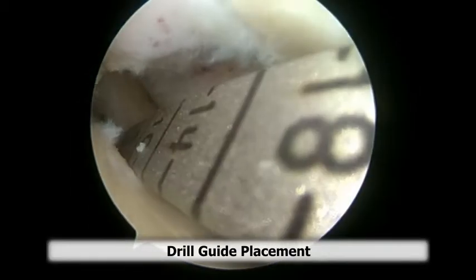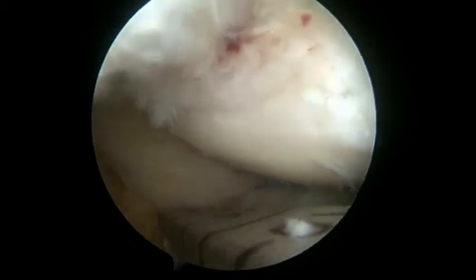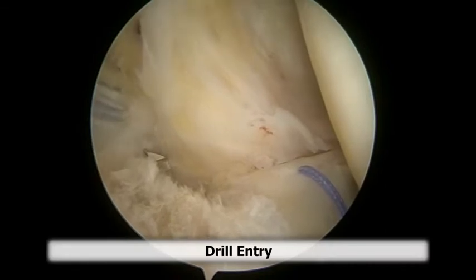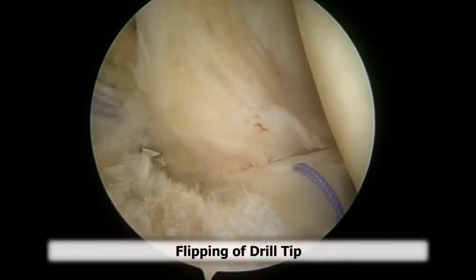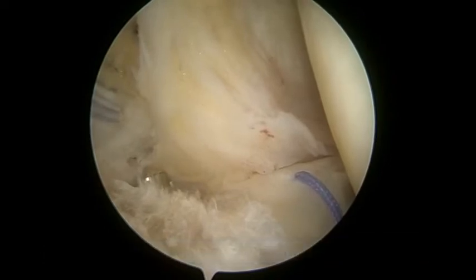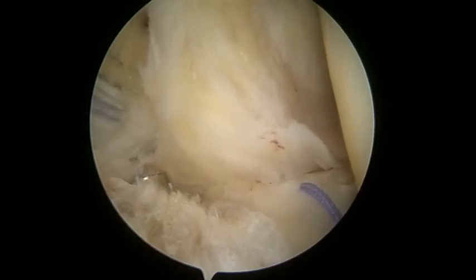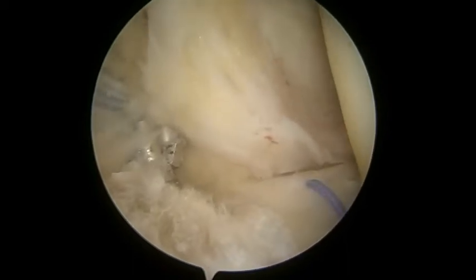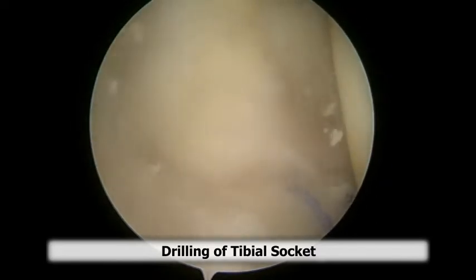Here you can see placement of a standard ACL tibial guide for placement of our drill. You want to visualize entry of the drill into the knee joint. We then begin the retrograde drill off of the bone and prepare the tibial socket in retrograde fashion using this retrograde drill.